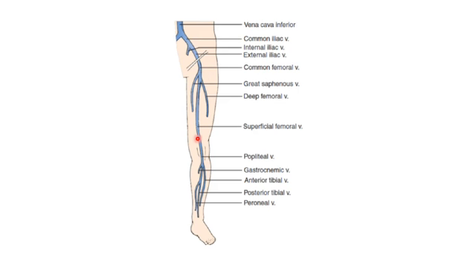The femoral vein itself is formed by the superficial femoral and the deep femoral veins. So all three veins join together to form the common femoral vein. So this is the most important part of the anatomy, or rather one of the veins. The other vein, as I said, is the popliteal vein, and this is formed by the various calf veins joining together behind the popliteal fossa.